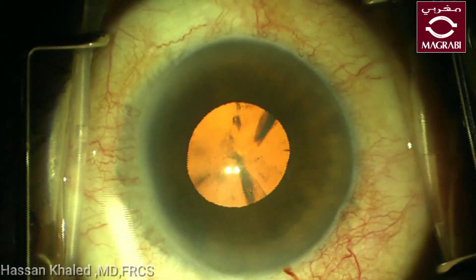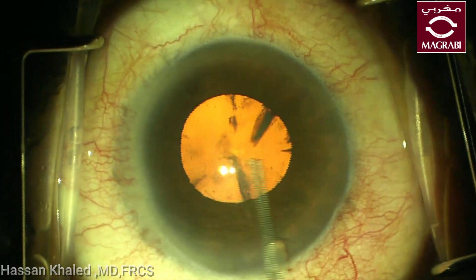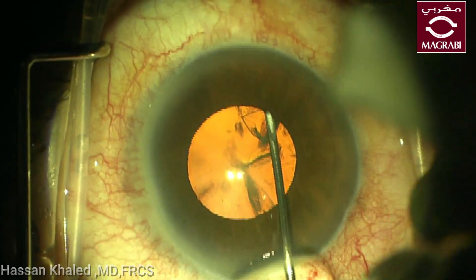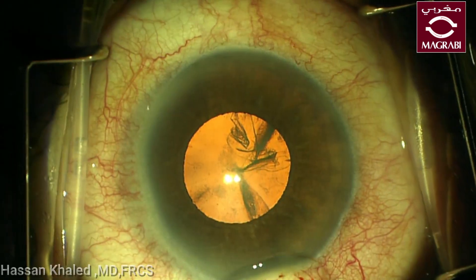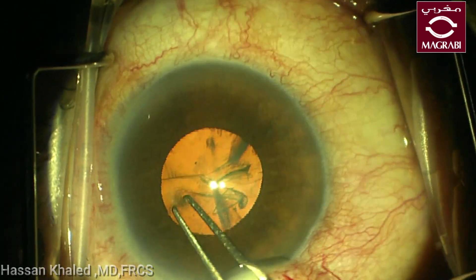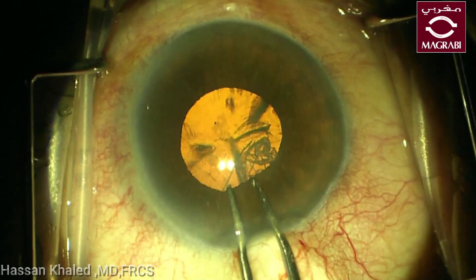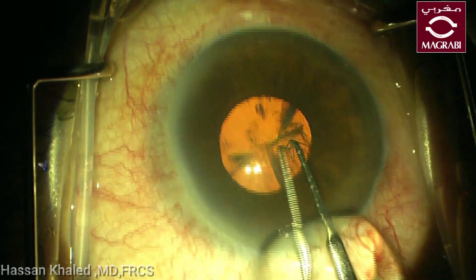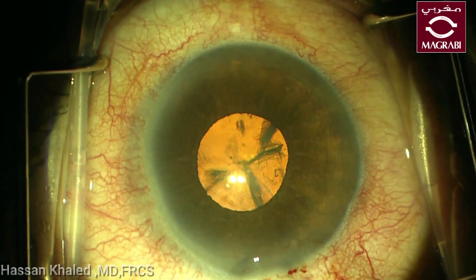Here is the second case with a narrow pupil, but here the pupil looks slightly bigger than the previous case. After doing a 2.2 millimeter corneal incision and injecting dispersive OVD, the capsulorhexis should be larger than the pupil diameter, so the edge of the rhexis should be behind the iris.